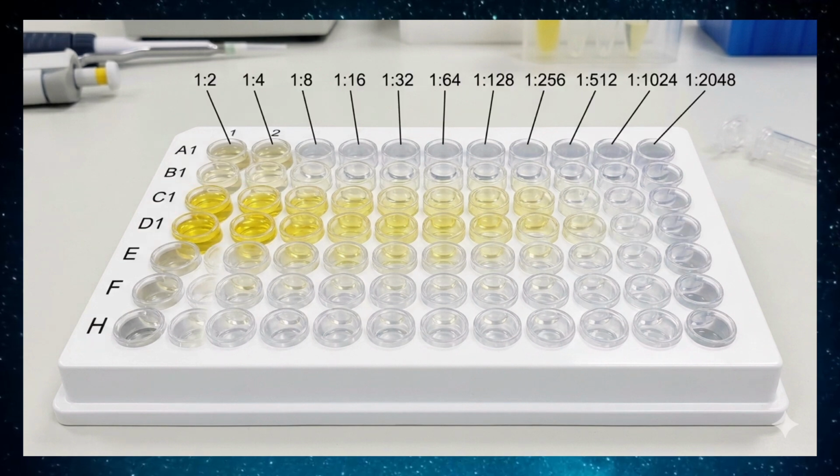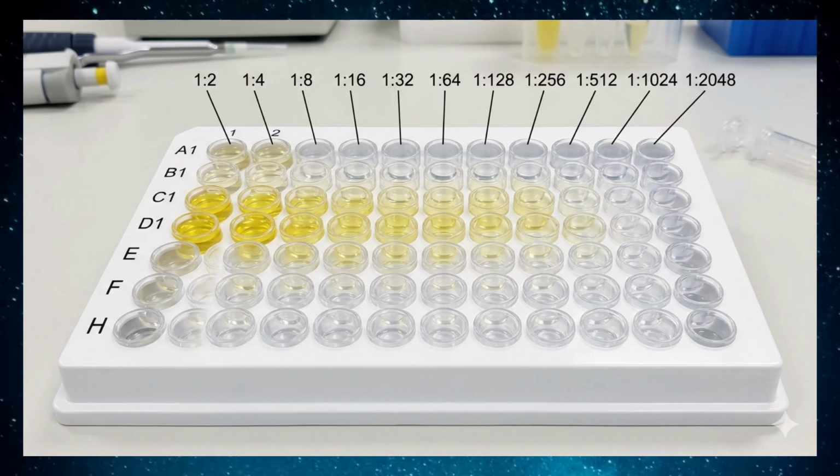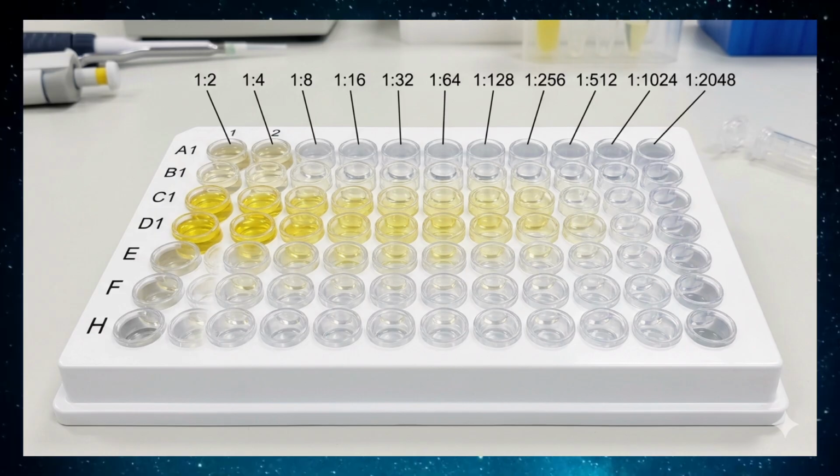The antibody titer is the highest dilution of the patient serum that still shows a positive agglutination reaction. For example, if agglutination is present up to a dilution of 1 in 320, but absent at 1 in 640, the antibody titer would be reported as 1 in 320. However, the exact titer considered positive depends on the particular test kit and laboratory protocol.